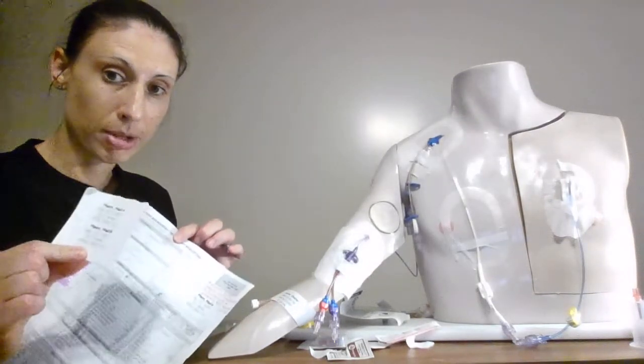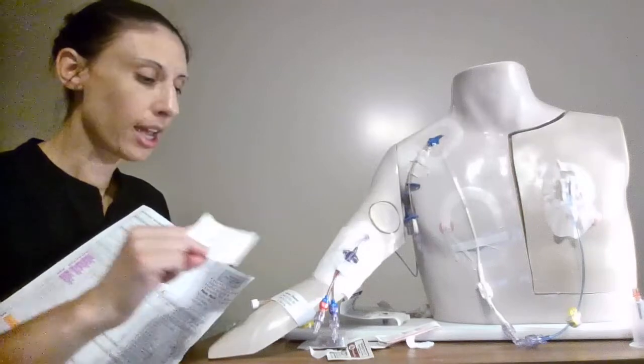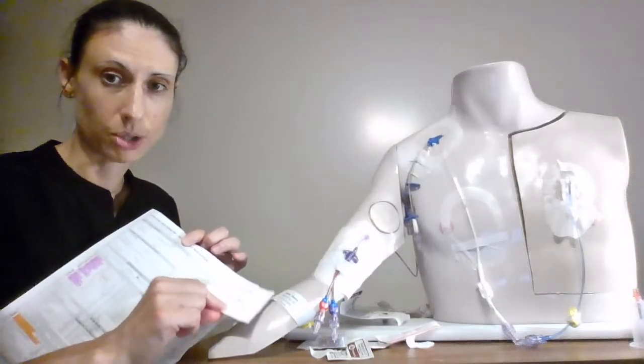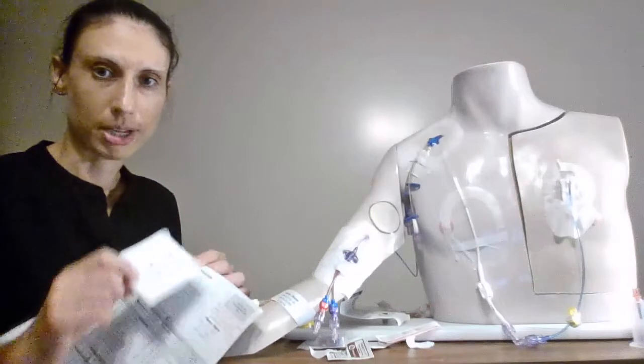As well I want to make sure that my label also matches my requisition and also matches my patient's name band as well. We want to make sure we're sending the right blood on the right patient.